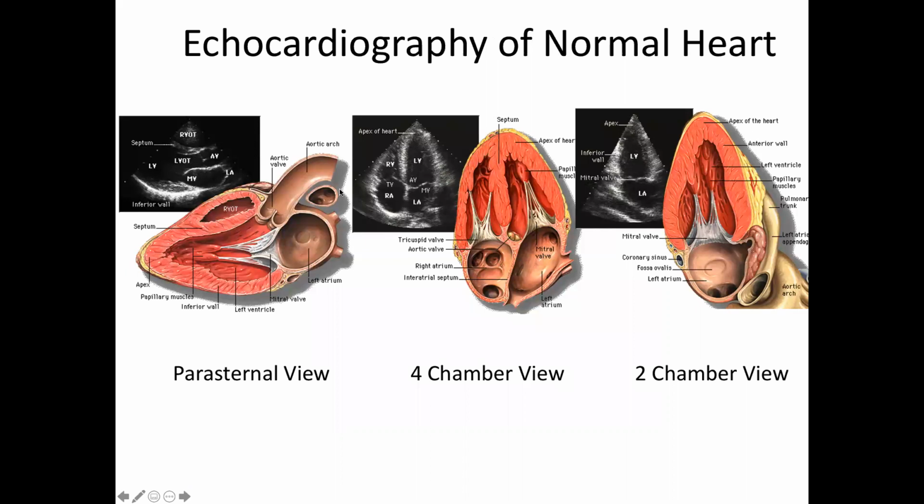The operator of the system learns to see a picture like this, which if you came in cold and looked at, you wouldn't actually know what is what, and map these features onto the true underlying features.